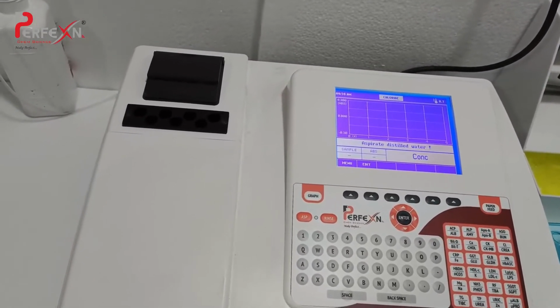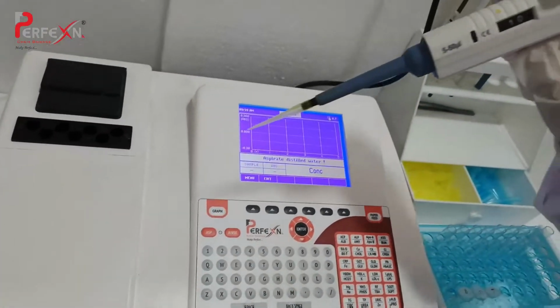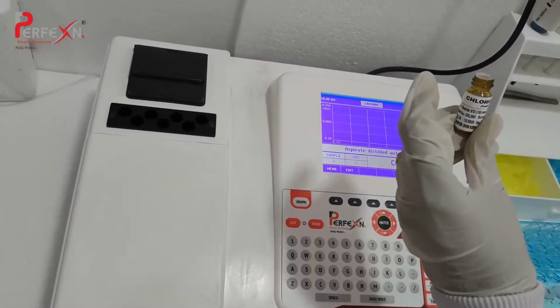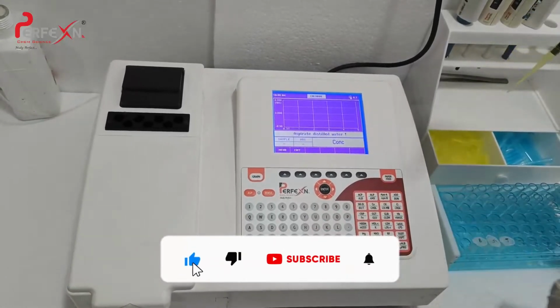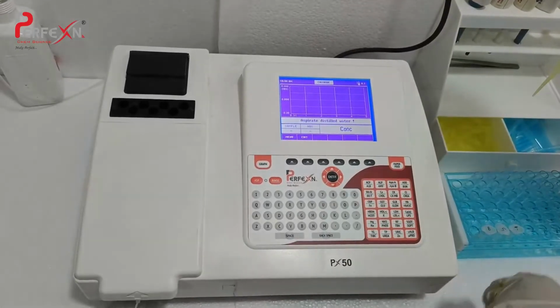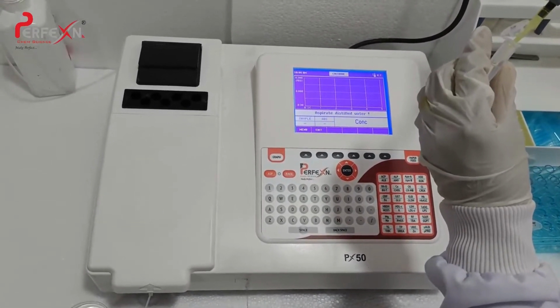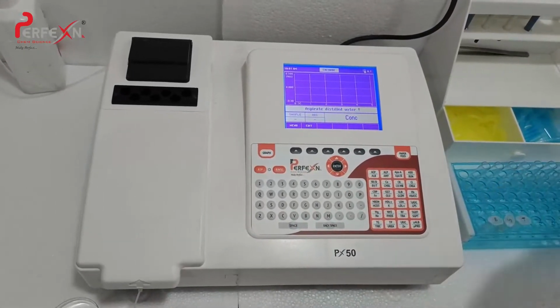the standard, that is 100 millimole per liter. I adjusted the micropipette to 10 microliter. Here I am adding the standard of chloride, that is 100 millimole. Take the standard of 10 microliter, wipe the excess. Now we have to add it to the standard labeled tube. We have to incubate for 10 minutes at room temperature.